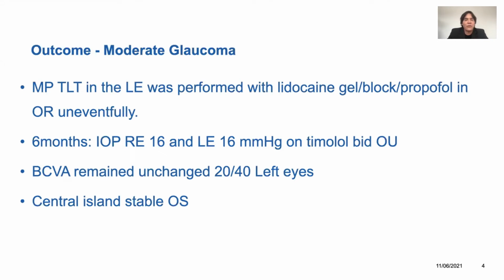He may need additional therapy. This is about a month or so out. I was 6 months out at this one. He's had a little creep, but no change in his parameters. So we'll see. He certainly might need a lower pressure, but we dropped him from 40 to 16 in the course of 6 months with a lot of therapy. So that's my case. Tomas, what do you think?